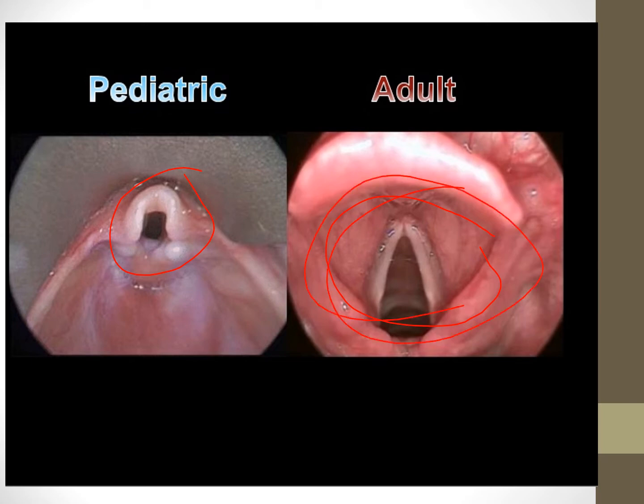It was amazing. It was like, man, that's the biggest airway I have ever seen, right? Because my comparison was over here. That was my baseline. And so for me, it was like a Mack truck highway type situation. It was like, okay, I can get an ET tube in there, right? So you're going to see the difference between the two.